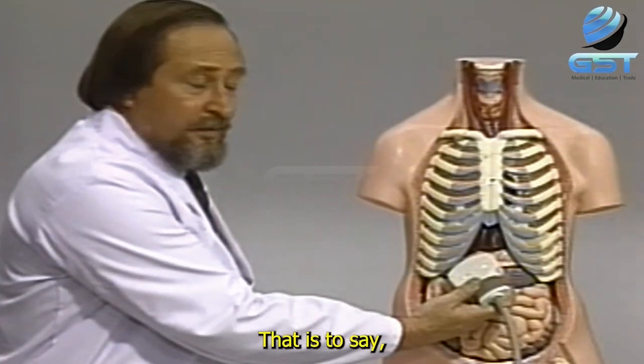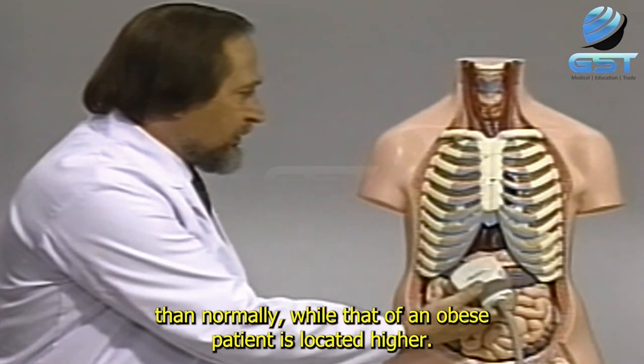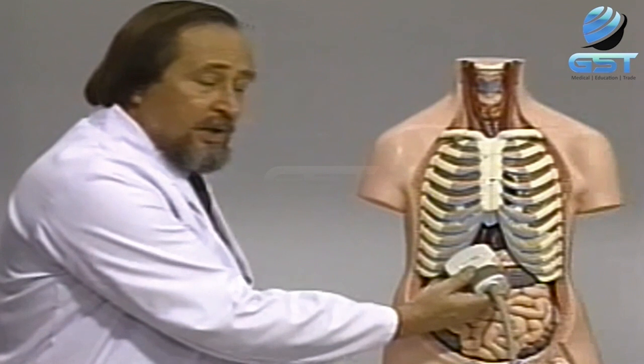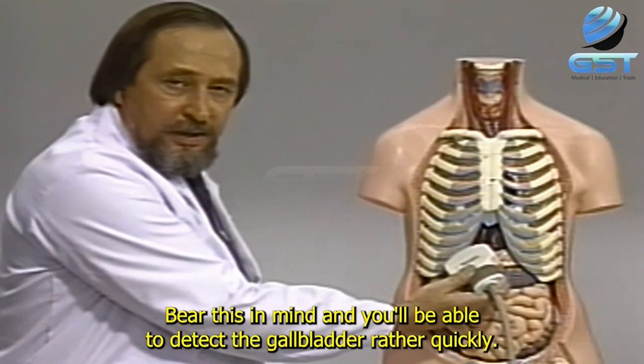That is to say, in a lean patient, the gallbladder is located lower than normally, while that of an obese patient is located higher. Bear this in mind, and you will be able to detect the gallbladder rather quickly.